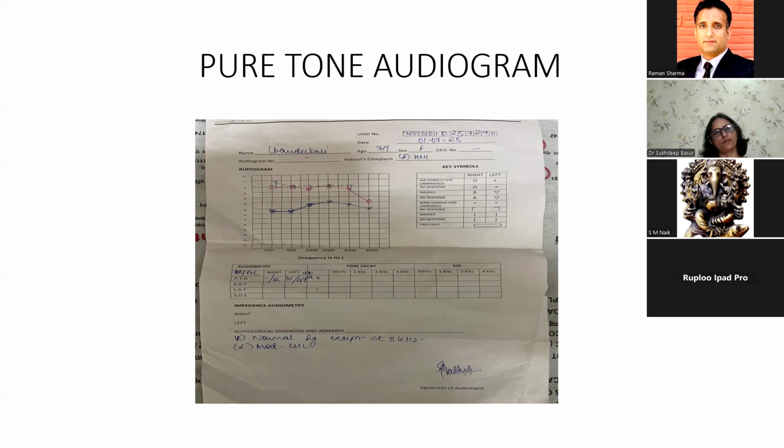You missed a good layer from where the most bleeding occurs. The subcutaneous layer has the most bleeders, and that is what you have to control, so keep that in mind. Yes sir, skin, subcutaneous tissue, and that is how you go. Then McEwen's triangle is identified and drilling is started in the area.